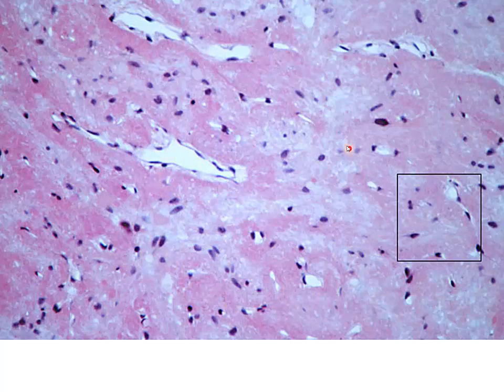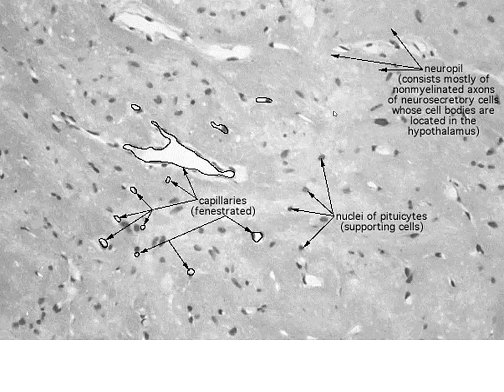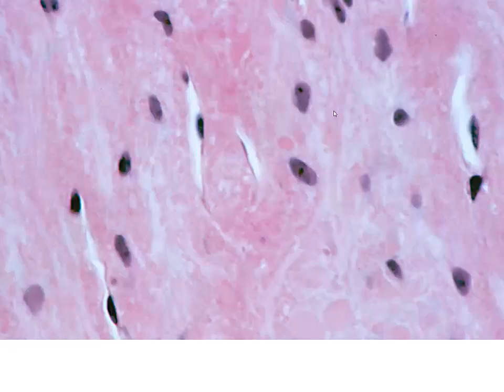So this is a slightly higher magnification view of our pars nervosa portion of our neurohypophysis. And again, higher magnification, we can see that mottled look. These droplets of tissue that we see, that's going to be the herring bodies in that portion of the neurohypophysis.